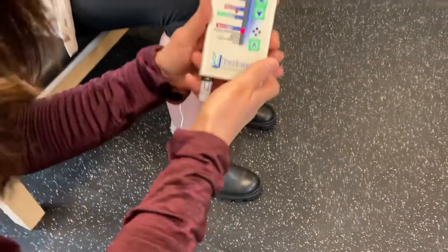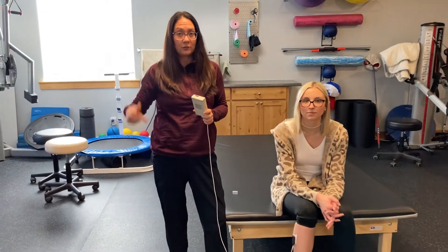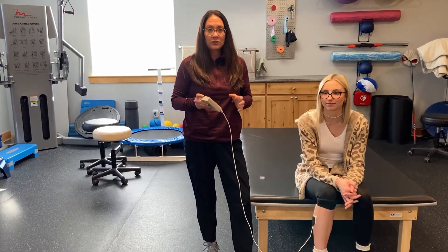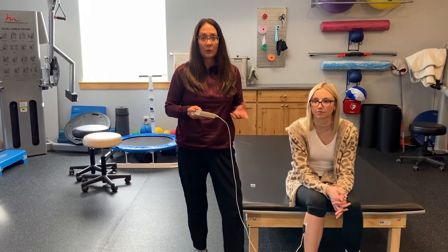The really nice thing about this piece of equipment is that it's handheld, so Sassy can hold it and watch it, and she can really work on finding that muscle and retraining her brain to find that muscle appropriately. As she gets better and stronger with better motor control, she can even do some dynamic standing and balancing activities while working these muscles.